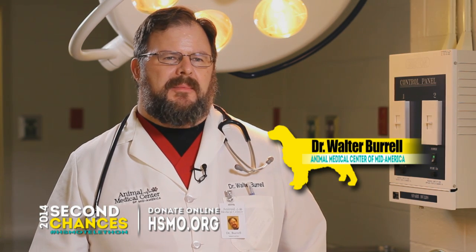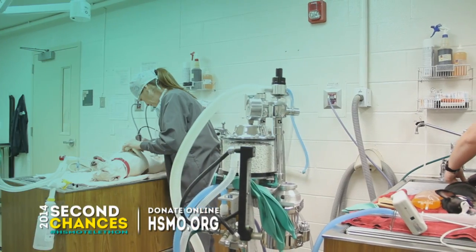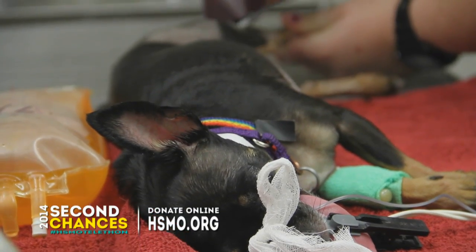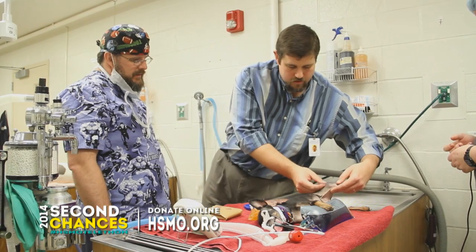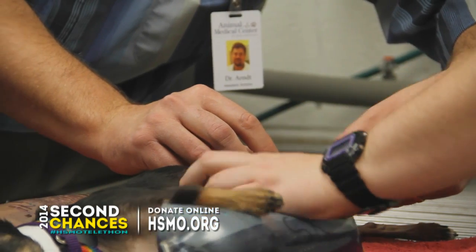It's a real common problem with very small dogs that their kneecaps pop out of place. Minnie's was exceptionally bad in that the kneecap wouldn't reduce back to normal position, so it made her very bow-legged, made her walk funny, and she limped on it quite a bit. So to do the goniometer, you want this centered over the joint that you're measuring.